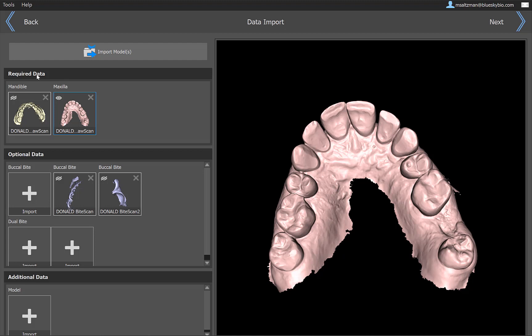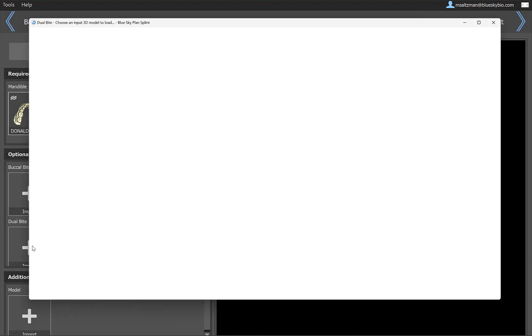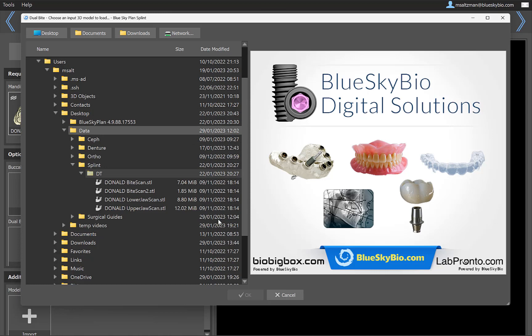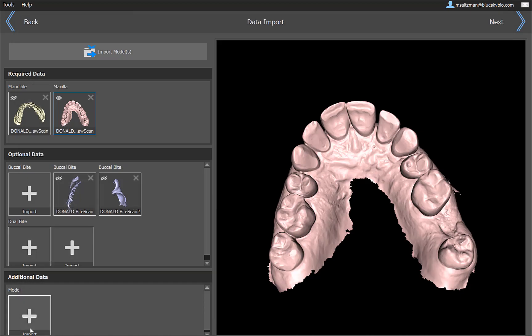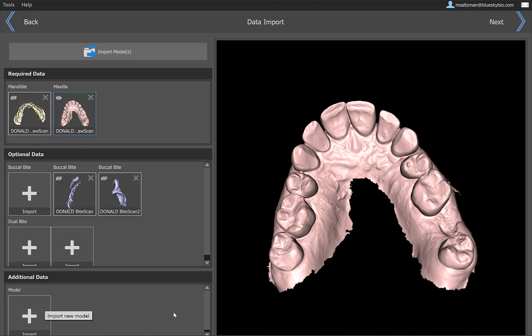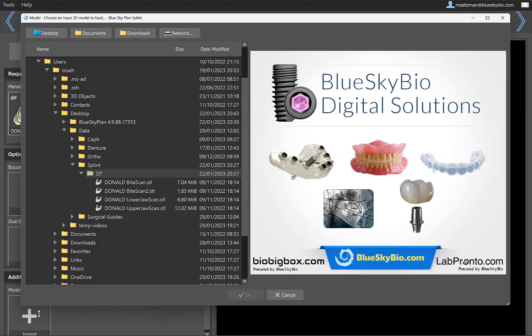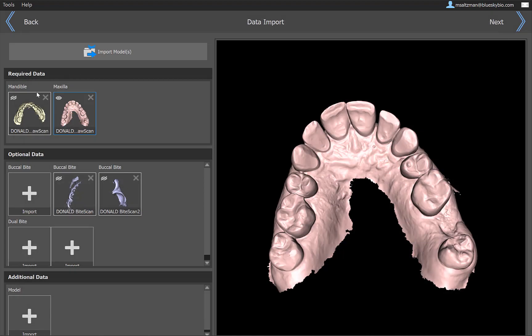The sections that we have here is that the top section is required data. It's the data that you must have in order to proceed. To create a splint, you must have a model. To create a surgical guide, you must have the CT and the STL. The optional data is exactly that. It's optional data. It could be a buccal bite, it could be a dual bite. If you have particular data saved in a particular location, other than what we just did, you could click the plus and select the relevant information. And then we have additional data. So if there's any other information that you dropped in and the software didn't automatically identify and organize, then it will show up in your additional data. And you could just drag it, grab it, and drag it to the relevant section where it's supposed to go.